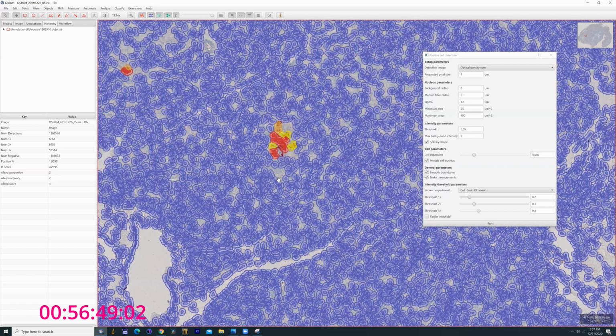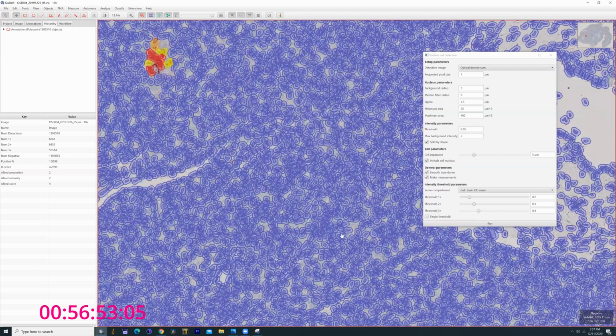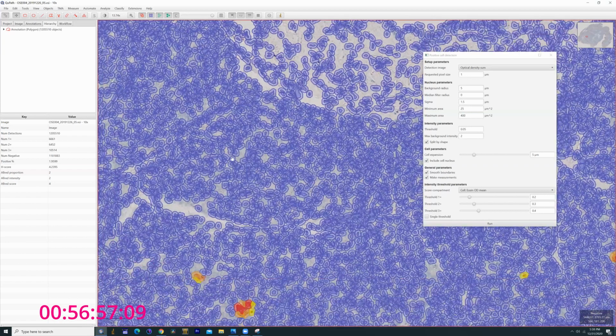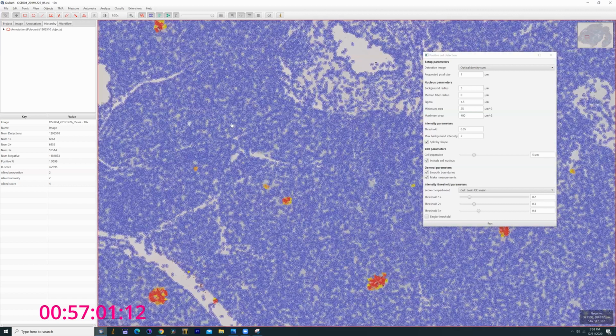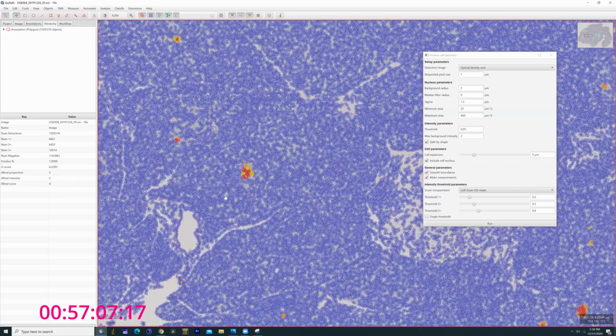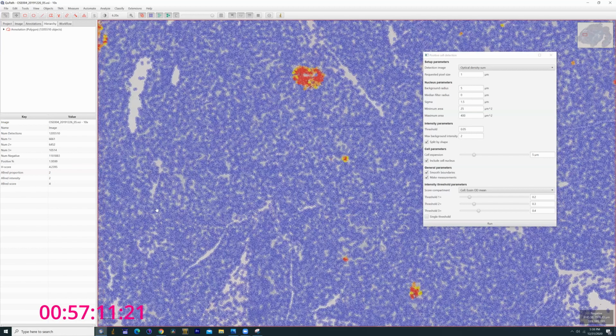So it's sort of nebulous. Part of it is the software, part of it is the tissue and the effectiveness of the stain. But by and large, I trust the rough numbers. And again, when it's all said and done, even with the refinement and the loss of a little bit of color, it looks like I'm going to come in around 2% again, 1.95.